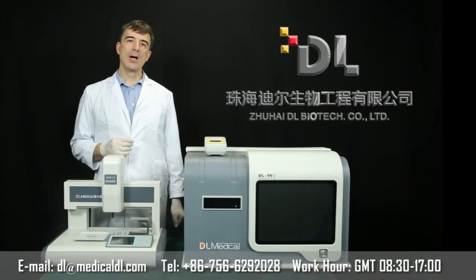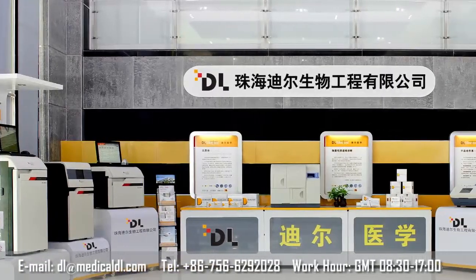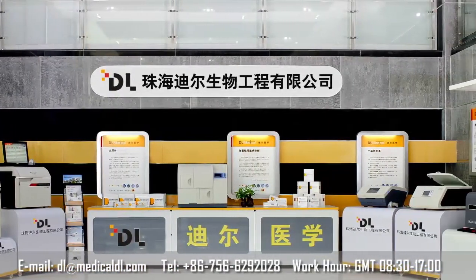In a word, DL is a friend you can trust, and we hope our products can make your work more convenient and hope you can enjoy your work. Thank you.